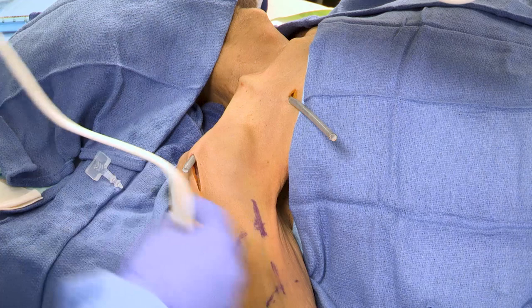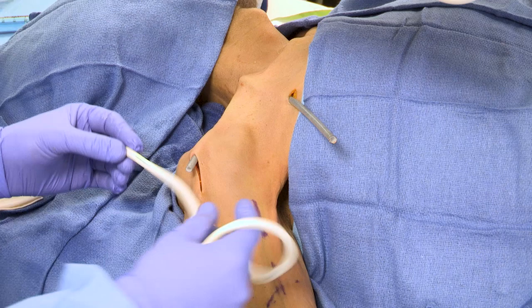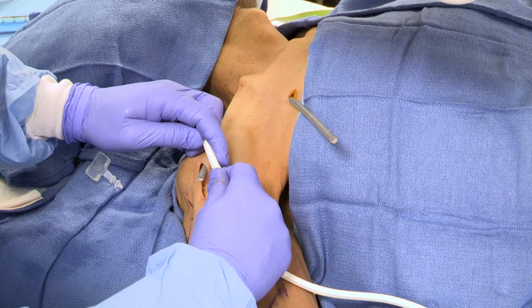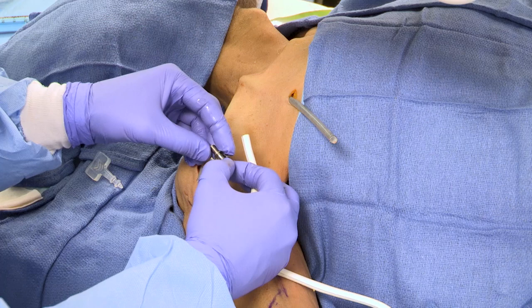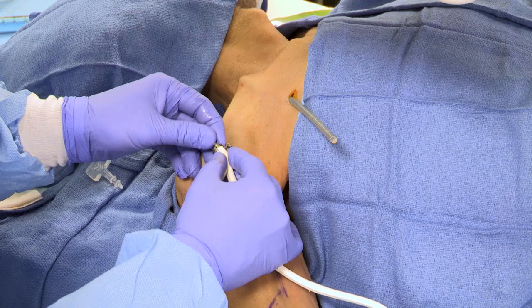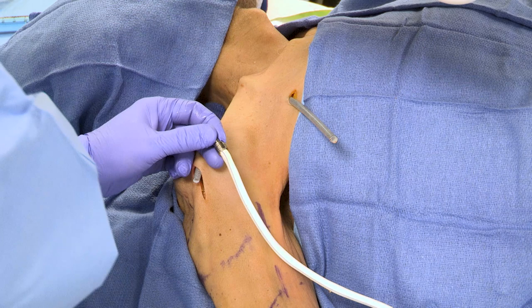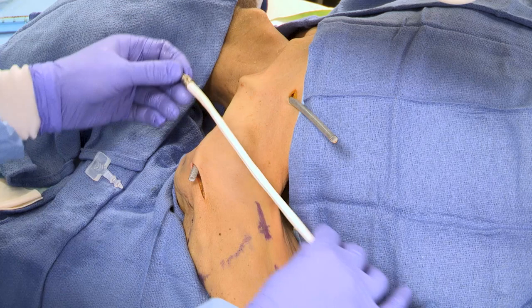If you're going to use a graft that's not pre-attached to the connector device — for example, an early access graft in combination with the outflow component — you can do that with the ally kit that has a rapid adapter. It's important to pre-dilate the end so that the adapter can go in. Insert the rapid adapter, which has a clamp portion that goes onto the graft. It's important that this goes all the way to the hub and sits smoothly against the flange. Then close it and use a clamp to tighten it further, making sure it's fully closed. After that it's secured very securely and will not easily come off.